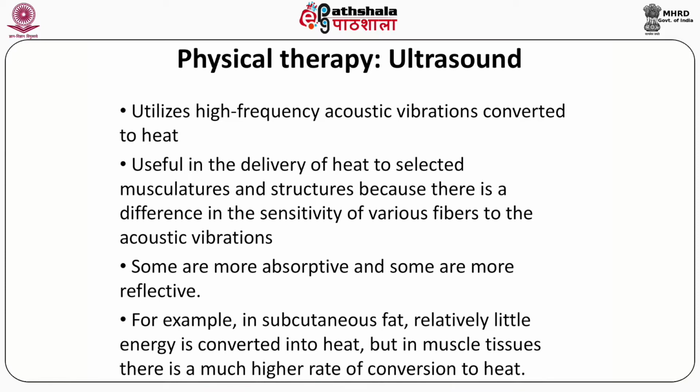It utilizes high frequency acoustic vibrations converted to heat. So the acoustic vibrations are converted to heat. This conversion is utilized by this technique. It is pretty useful in the delivery of heat to selected musculatures and structures, because there is a difference in the sensitivity of various fibers to the acoustic vibration. Some of these tissues are more absorptive and some are more reflective.